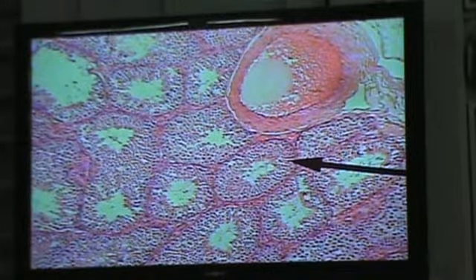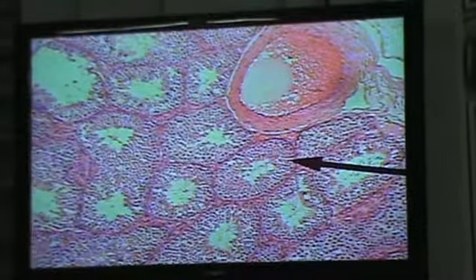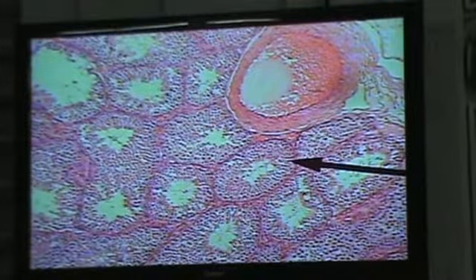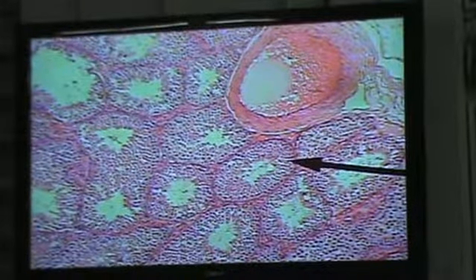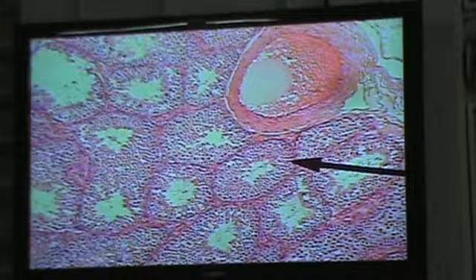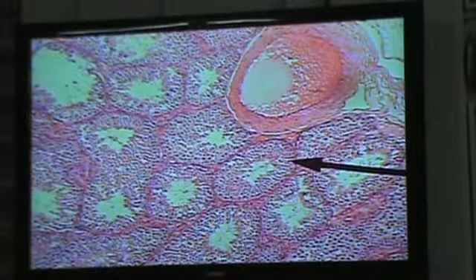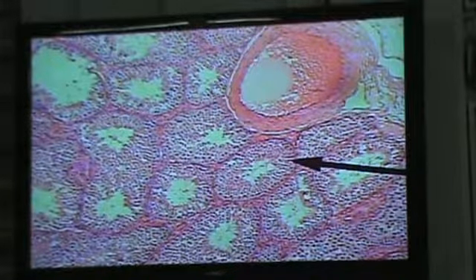And these stereocilia function primarily in the absorption of fluid. So as the fluid is absorbed, there's a flow going towards the what? The epididymis. So the first train station is the seminiferous tubule. Spermatozoa are produced there, and then drawn along in this flow of fluid to the little straight ducts known as the what?